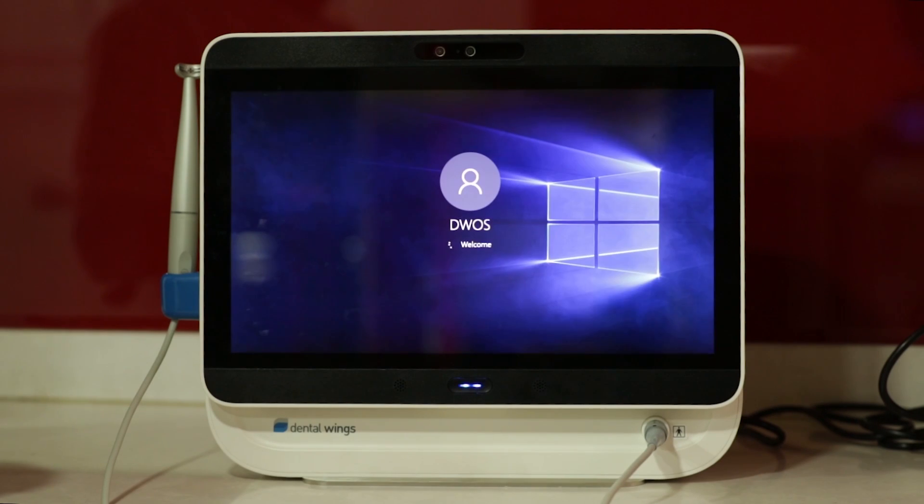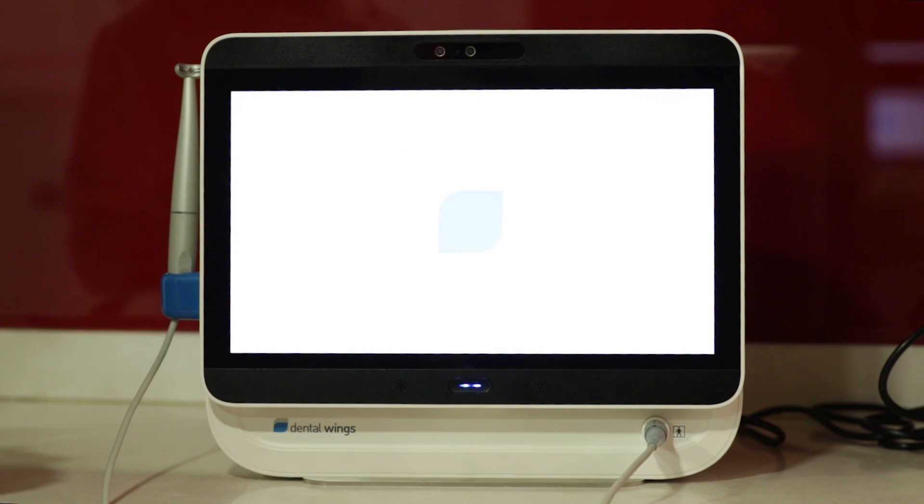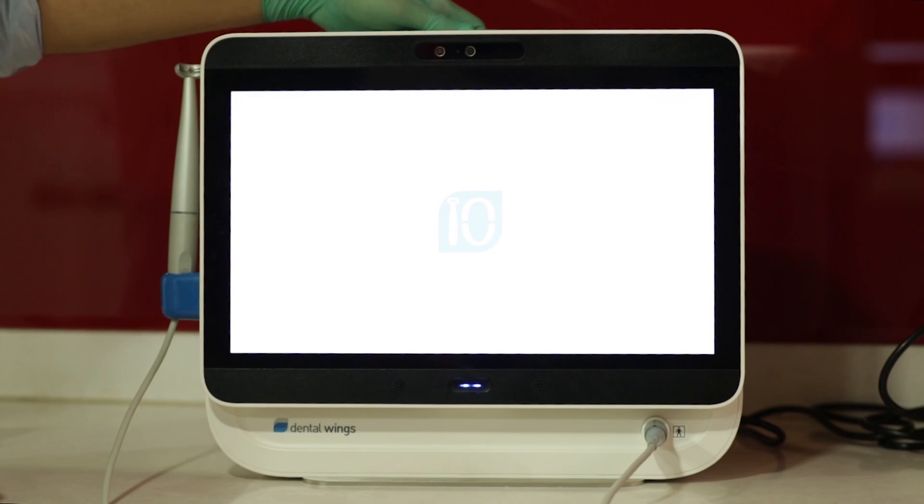This scanner is from Dental Wings Canada, which is great to have especially when you have some financial inhibitions, or if you just don't want to invest a big sum in the initial stages of your practice. This is a great way to kick start your digital journey. The Dental Wings intraoral scanner is also highly portable, so you can even carry it around when you go consulting.